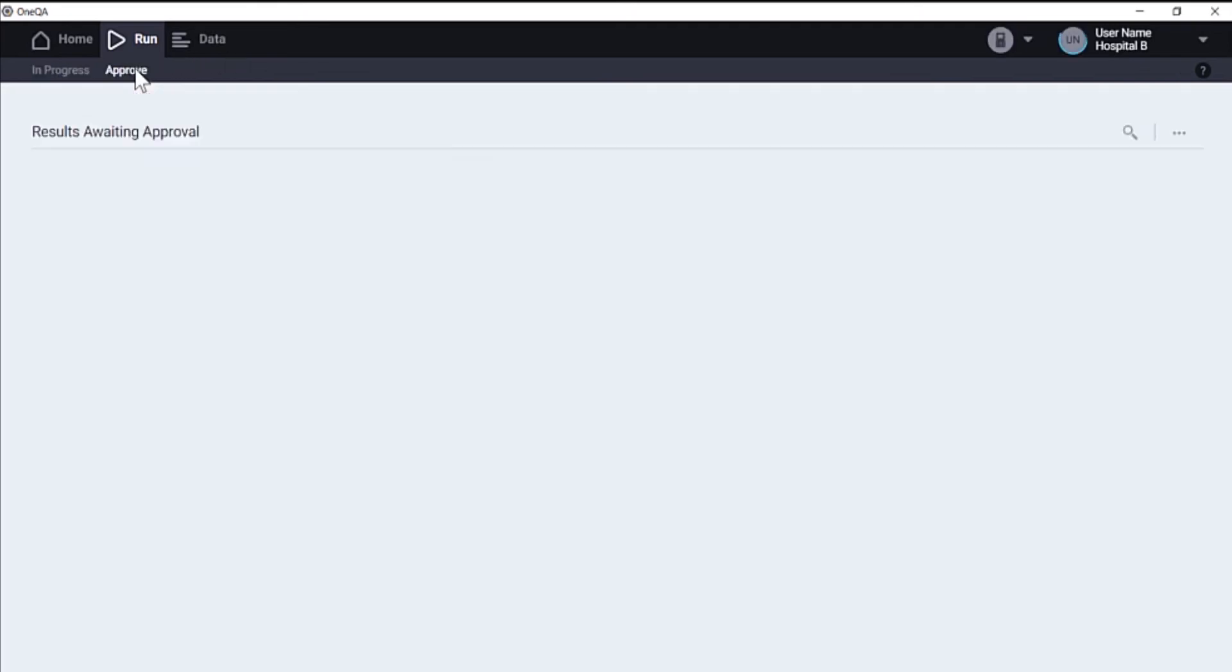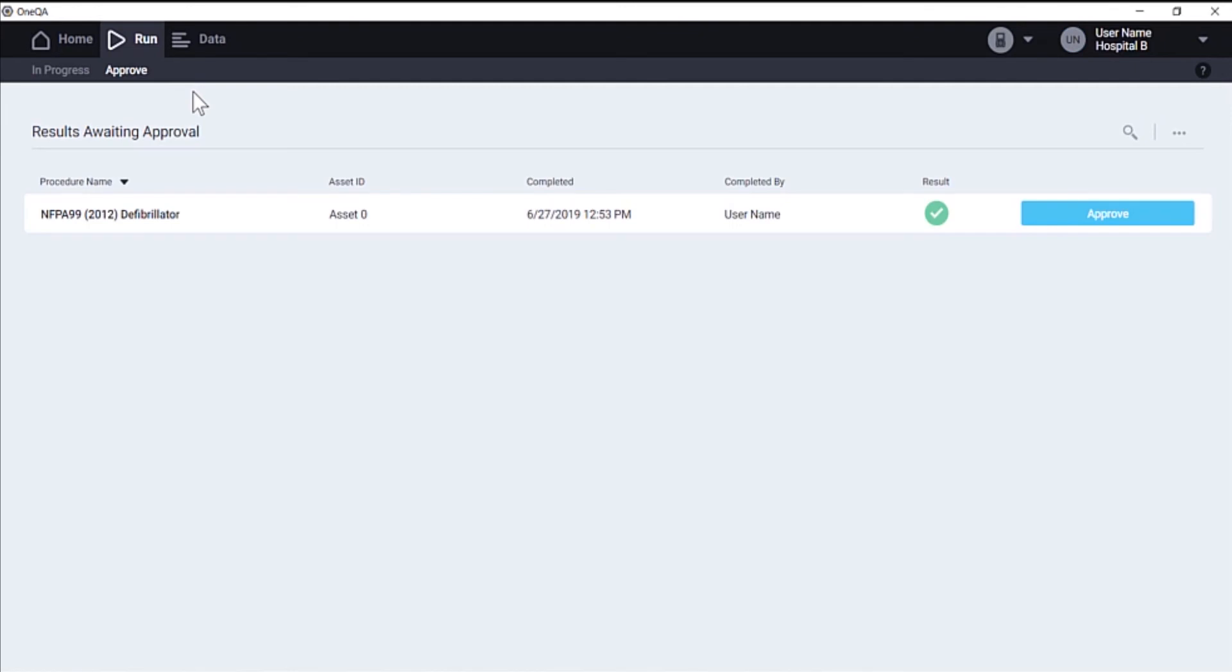Because in our tenant settings, we have required approval for test results, the result will appear here and wait for approval.